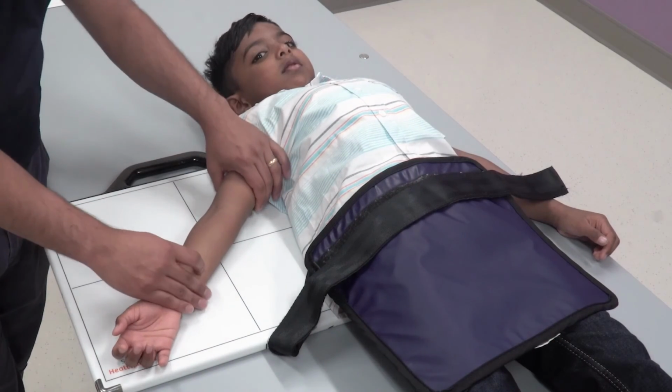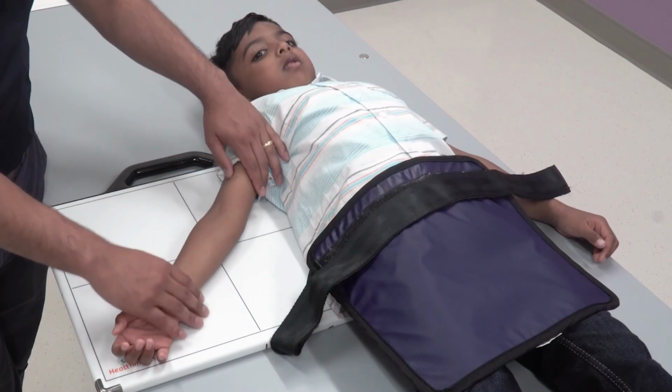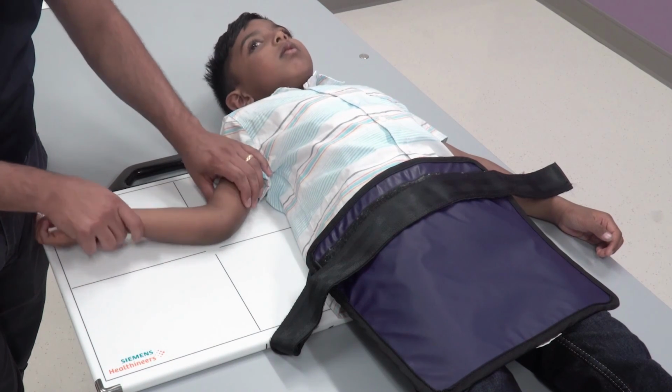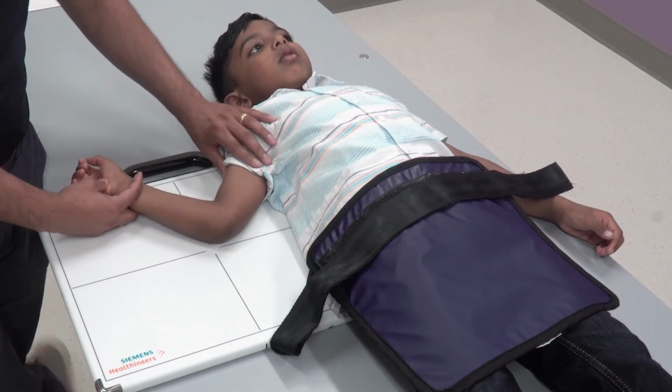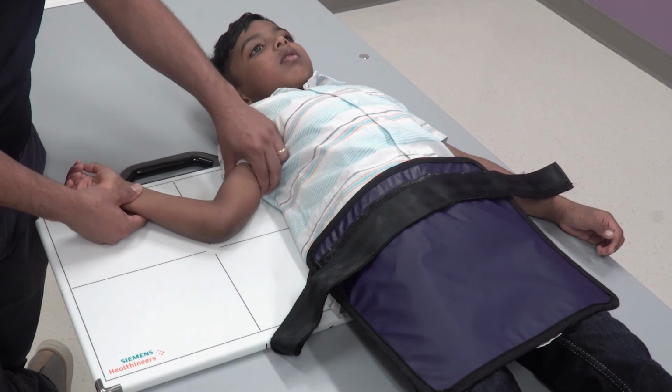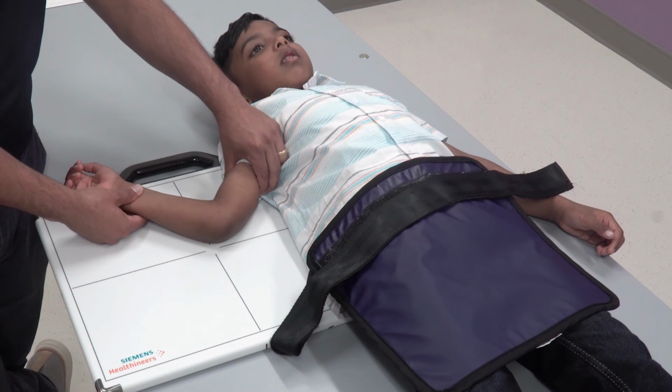Another great method for getting a true lateral of the elbow is what we call the stop sign lateral. So this is great for patients who aren't able to sit up straight or who have a difficult time holding still. So this is really good for some of our younger patients. So in positioning for the stop sign lateral, you want to ensure that the patient is supine. Flex the elbow 90 degrees, almost make a stop sign. One hand will be on the wrist and the other one will be on the proximal humerus.